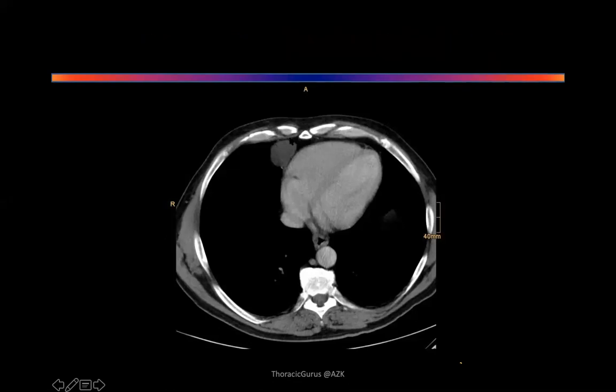All I want you to talk is describe the cyst to me, describe its relation to the structure surrounding it, and give me one or two diagnoses. That's it. That's what you do in life, isn't it? Don't overdiagnose. Don't diagnose emphysema or barrel-shaped chest and all that. There is a pathology staring at you in the face. Just please describe the pathology.